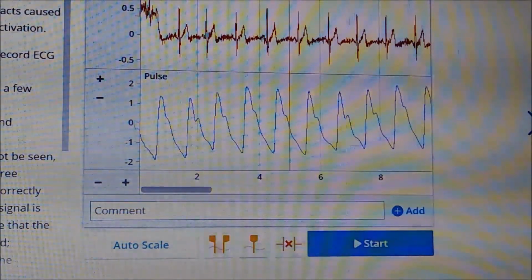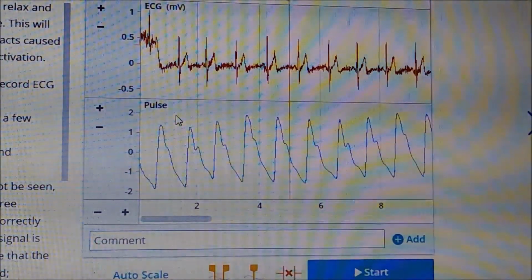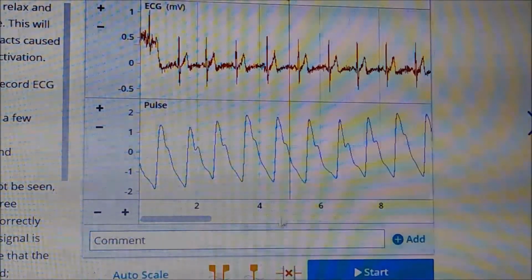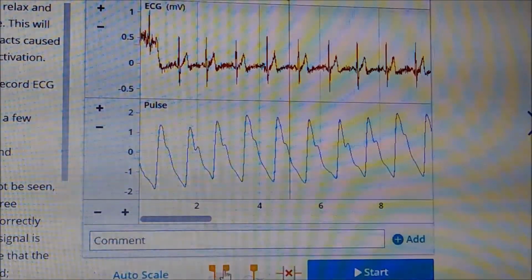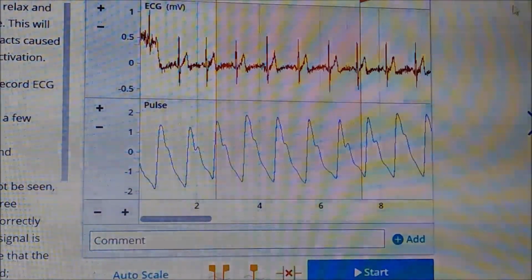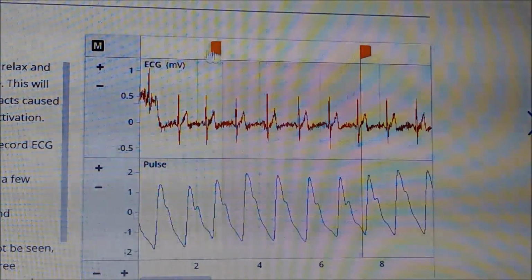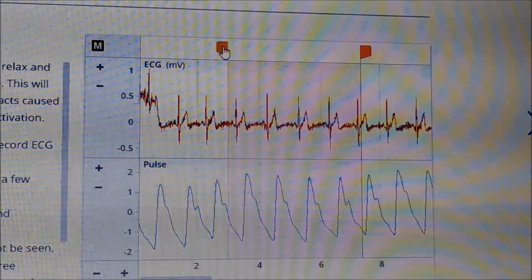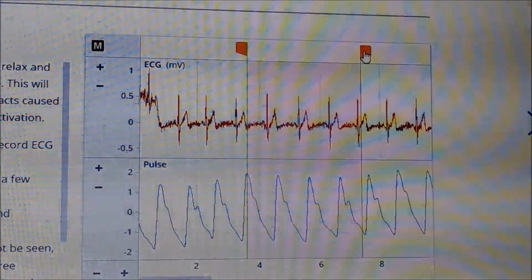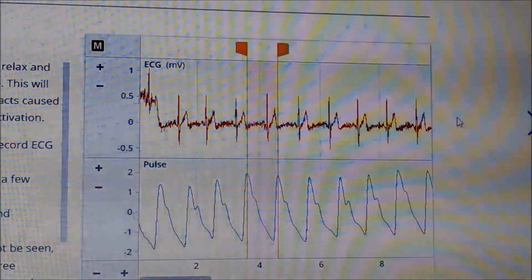So initially we want to calculate the beats per minute using the lower pulse window. So you can ignore the ECG at the top. And what we want to do is use our bracket tool. So we can click on that. It's at the bottom. It will present us with 2 brackets. We want to move one bracket to the crest of one of the pulse waves. We're going to move the other bracket to the crest of the adjacent pulse wave.